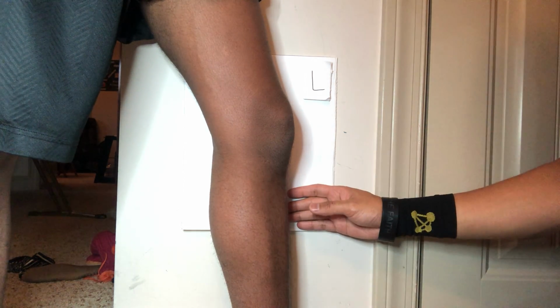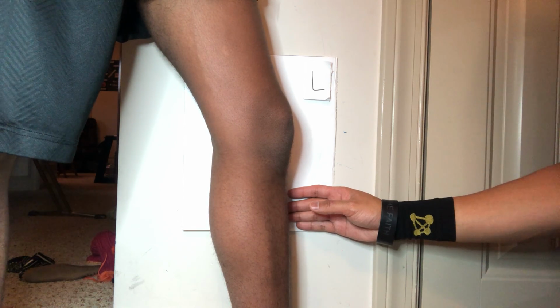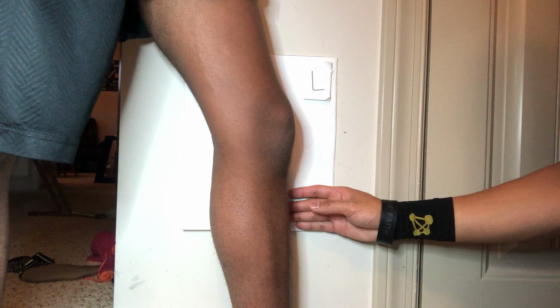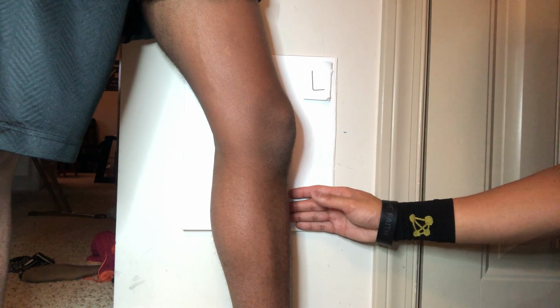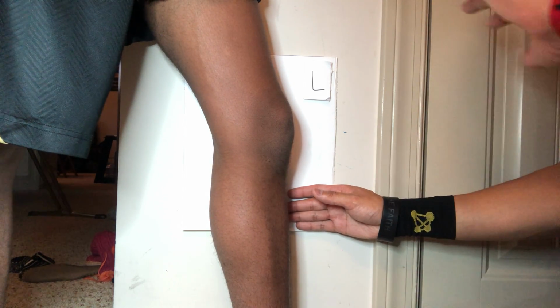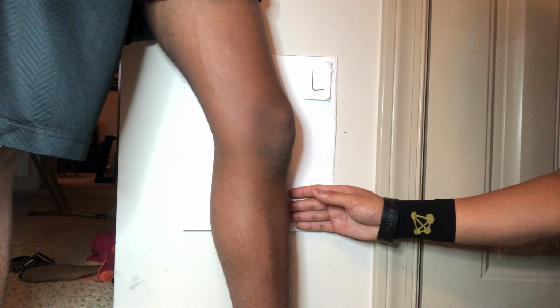So these are your normal views for the knee standing. Again, if we're doing these in recumbent, we would have some tube tilt indicated with the recumbent position for proper projections. We're going to ask the patient not to breathe and not to move. With all the projections, we're also going to shield the patient for protection from radiation.